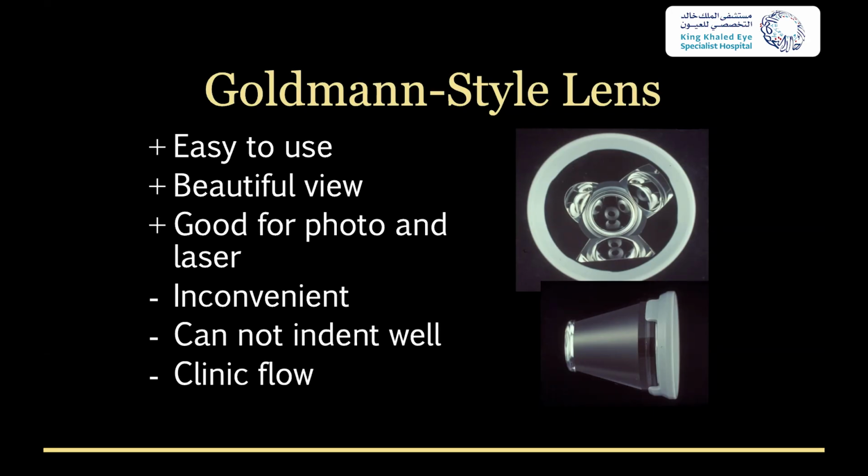However, if I really need to see something, I'm lost with my 4-mirror lens. It is a better view. And we use it to get all these videos that you see. We use a thing called a MagnaView lens, which is a 1-mirror lens. So it's a great lens to have around, but for your day-to-day use, I would use one of the 4-mirror lenses. And if you are going to use a Goldmann lens, you use the short mirror. That's the one that points at the angle.